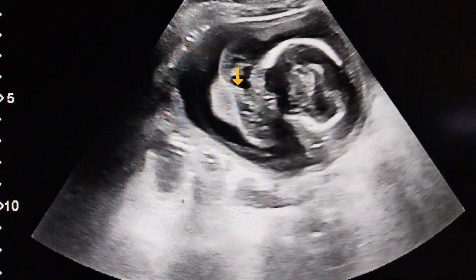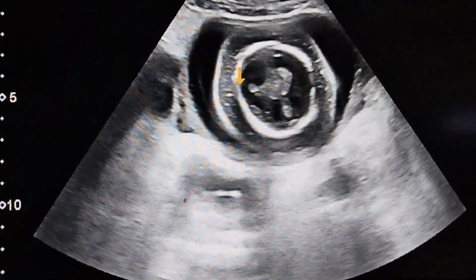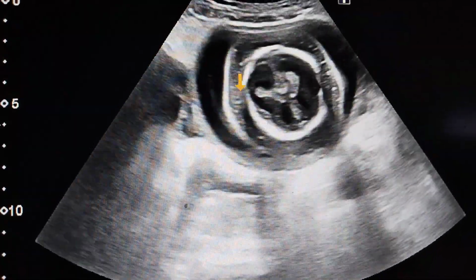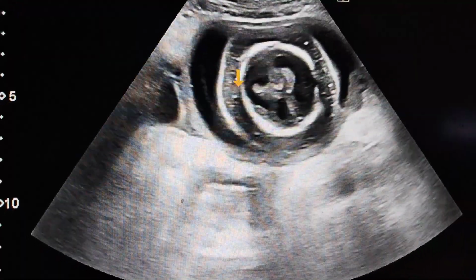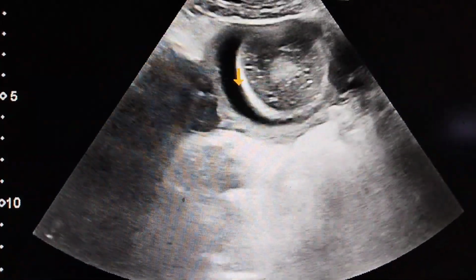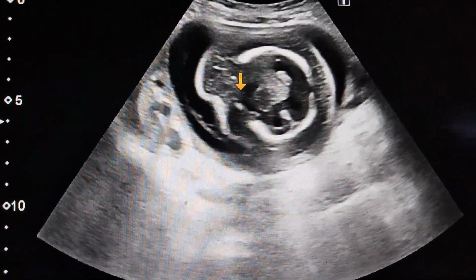So I have seen this patient's brain thoroughly. I could not find any calcification within the fetal brain, and also the patient is not giving any history of infection, any history of vaginal discharge. So one is this cause, the TORCH infection.